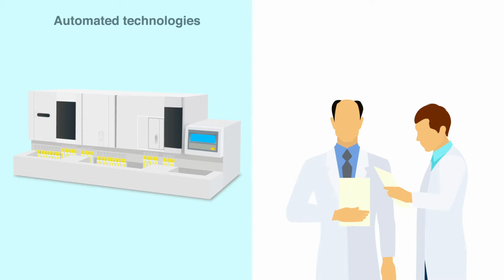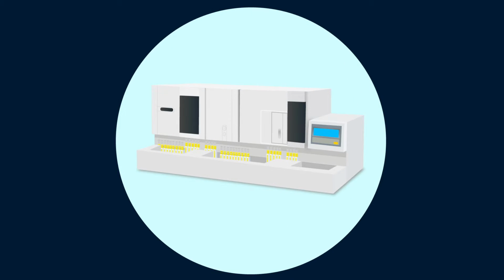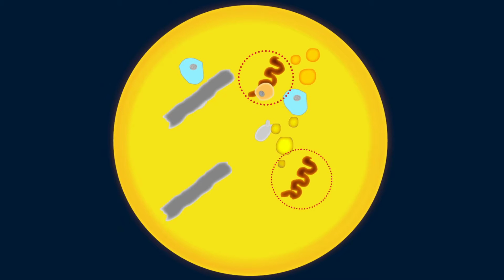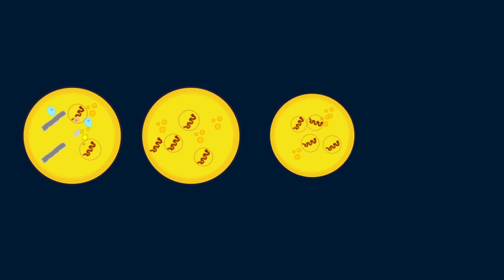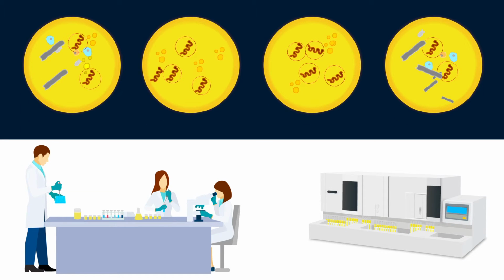Scientists from the Department of Laboratory Medicine at Ghent University Hospital, Belgium, reviewed the most recent developments in automated urinalysis and its future perspectives. Advances in microscopy have enabled more efficient sediment analysis, which remains a key method of diagnosis. Automation and progress in informatics have also improved pattern recognition workflows, enabling high output throughout clinical laboratories.